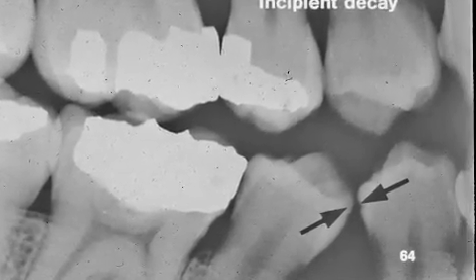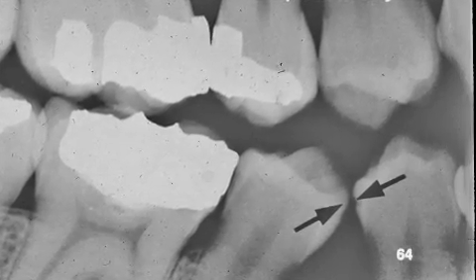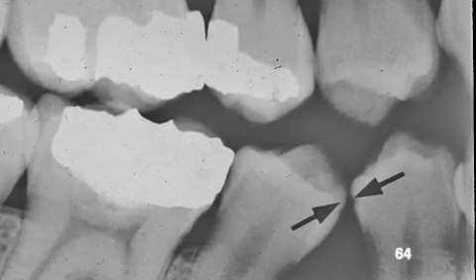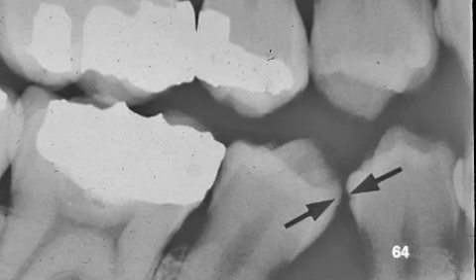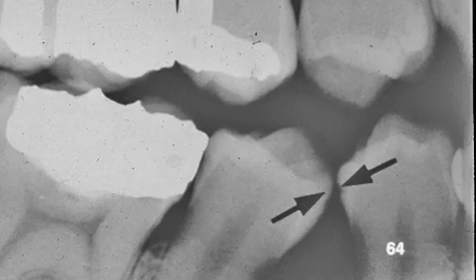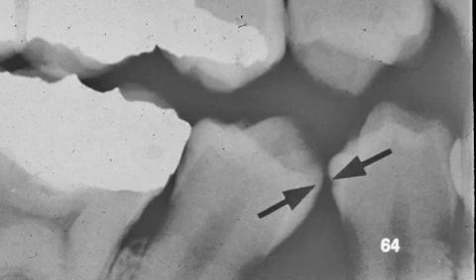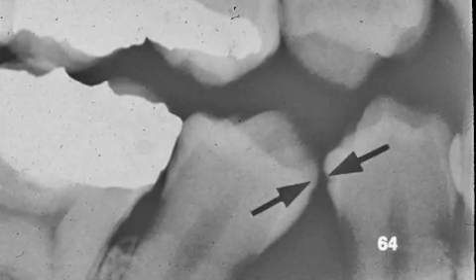This is the patient's right side on the bite wing. The arrow to your left points to a radiolucency — incipient decay. Incipient decay is less than halfway into the enamel.